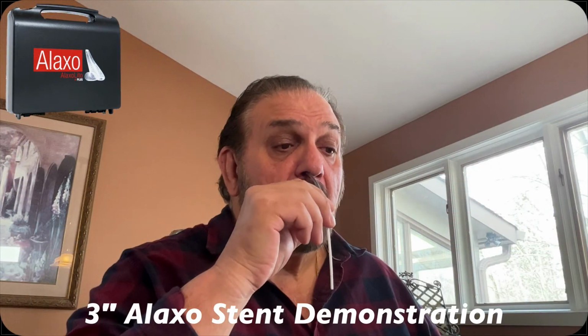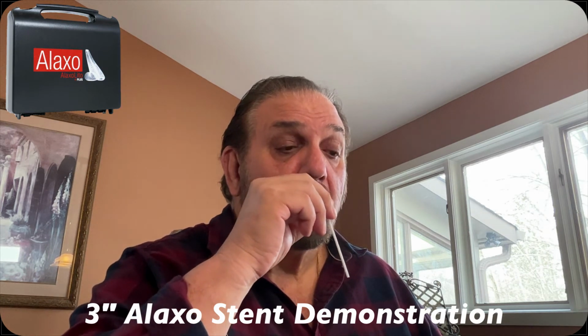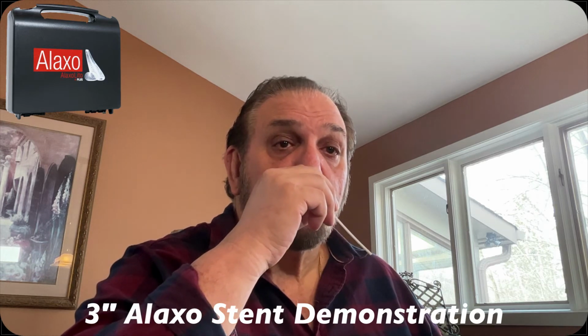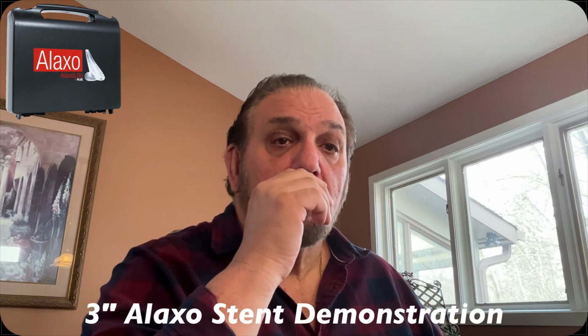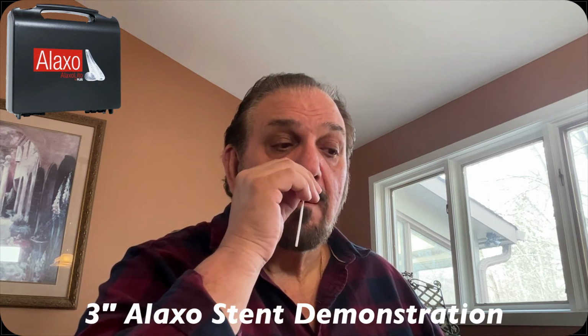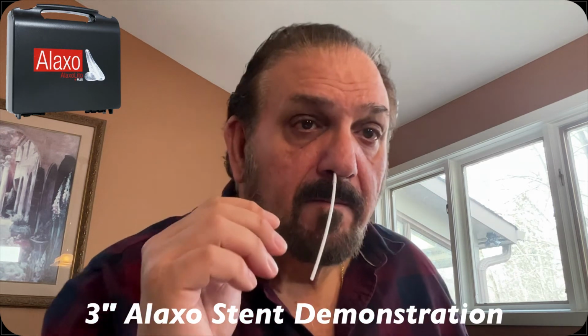Well, I will tell you, Doctor, that you're not the first to have this experience. This is very common. And a lot of people have never, and we've always been told, don't put things in your nose. So a lot of people have never inserted something into their nose. So when this is the very first, look at you. Okay, where's the end of your tube? It looks like it's in there to me.